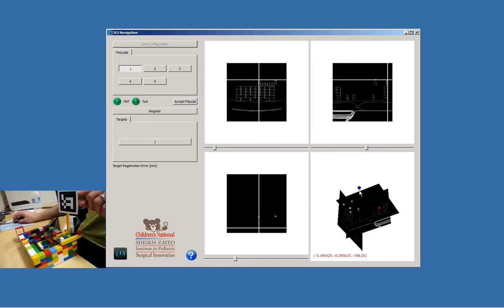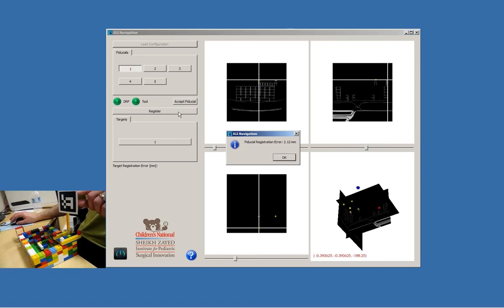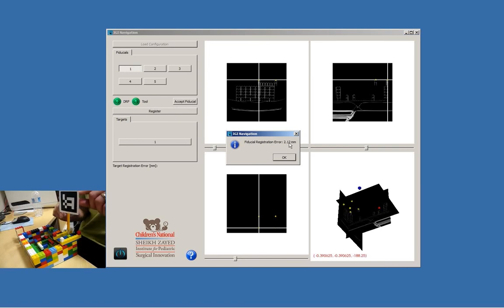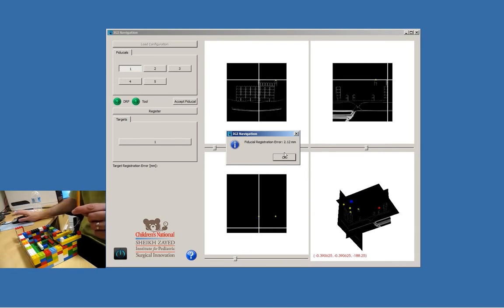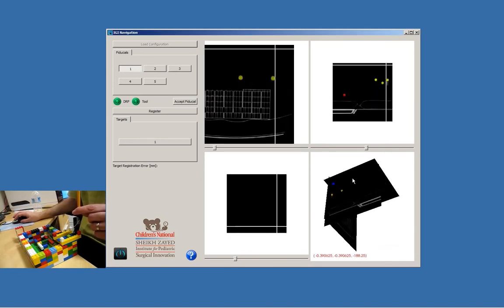Obviously before registration it's not in the correct place. Now we register and we have a fiducial registration error of 2.12 millimeters. That doesn't really reflect the quality of registration — it just says that the points we digitized in the real world are pretty close to those that we identified in the image.